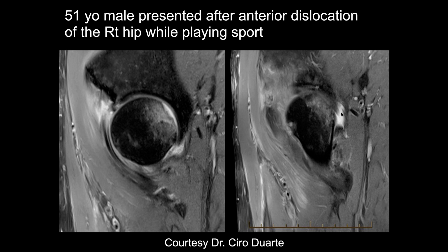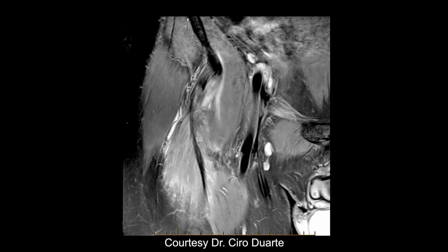A 51-year-old male presented after anterior dislocation of the right hip while playing sports. There is anterior superior labral tearing and what appear to be small paralabral cysts, along with a defect of the femoral head posteriorly — probably a Hill-Sachs-type lesion from impaction against the anterior superior labrum. What's unusual about this case is that it's an anterior dislocation, which are far less common than posterior dislocations — roughly one to nineteen in ratio — and rarely seen in practice.